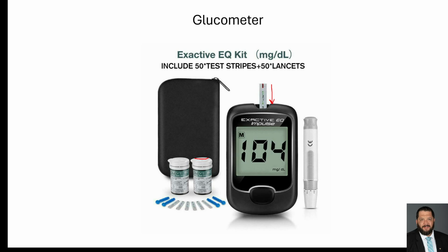You'll have a capillary bed here at the end where the blood will go. And you typically have a lancet device. You'll clean the patient's skin, typically the finger, with alcohol. Let it dry completely. Puncture the skin with the lancet device and place the capillary test strip into the drop of blood that's present on the patient, and that will give you a reading.